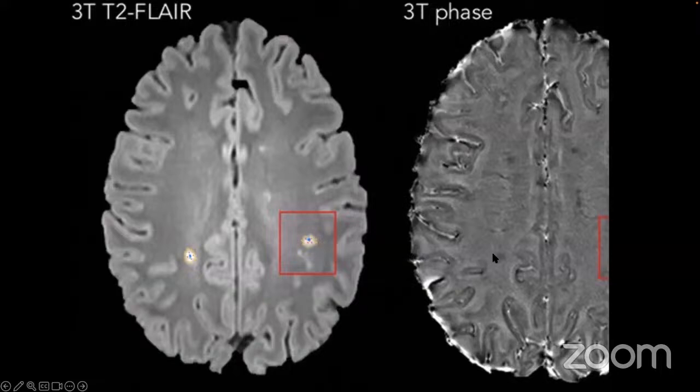And because we have a sequence with iron susceptibility, you would expect in the chronic lesion to start to develop some hypointensity in the SWI sequence or the gradient echo sequence. This process, the hypointensity, the iron deposition, is driven by the microglia and the macrophages, but by abundance, it is the microglia. So the microglia deposit a lot of iron, and this iron can be picked up in the SWI.